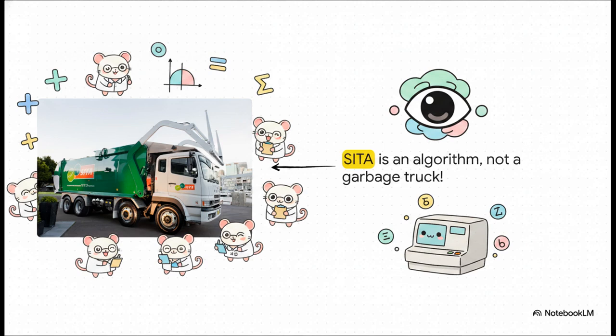Basically, the machine is constantly asking itself, based on this patient's age, our normal databases, and how glaucomatous defects usually evolve, what is the most likely threshold right at this exact spot? It's so smart it even adapts to the individual patient's reaction time.